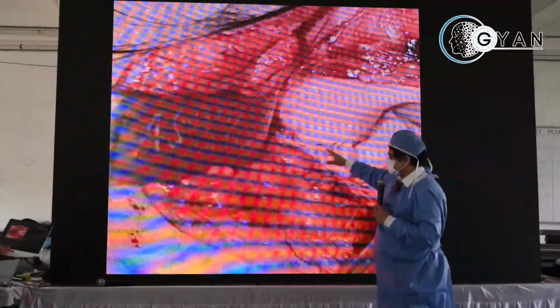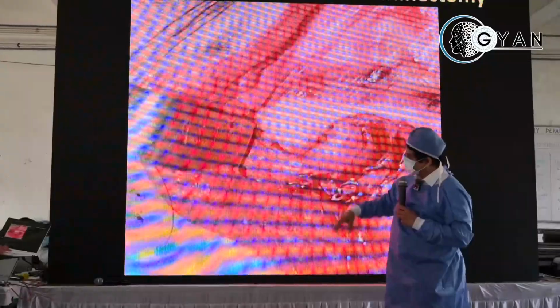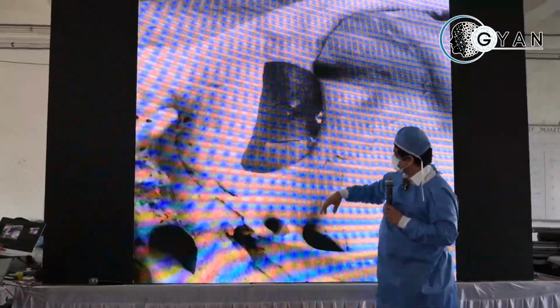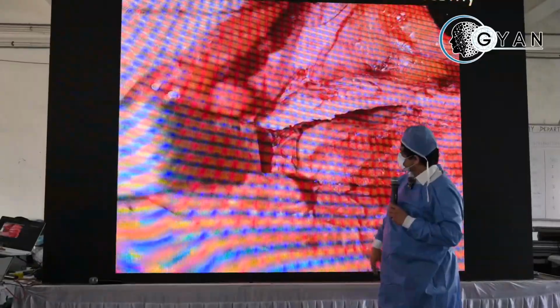After eminectomy, next. So now we have done the eminectomy.